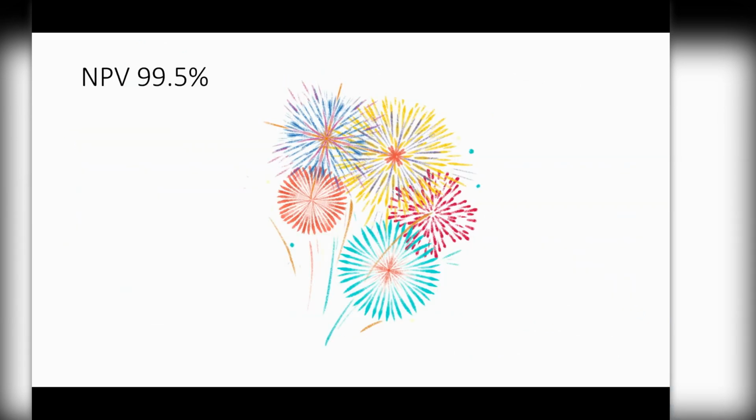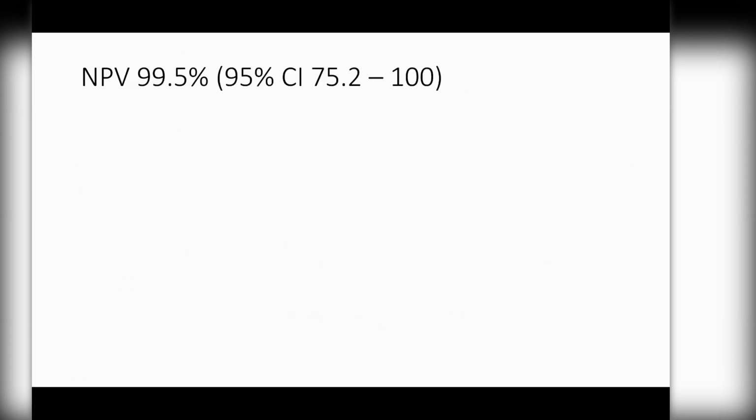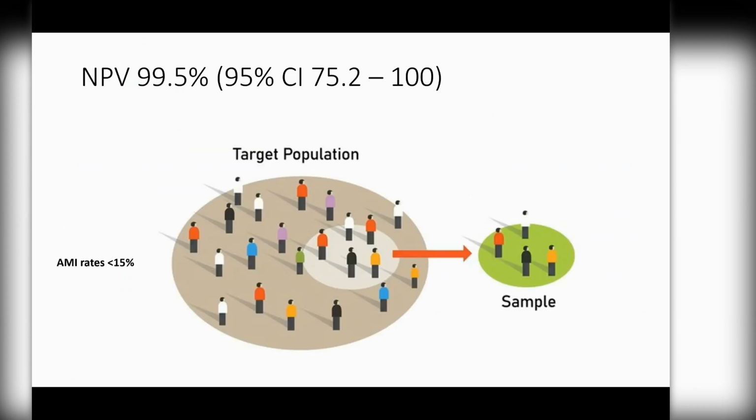And just as a tiny little segue before I end, one of the things that I look at when we see a number of publications in this area is you often see people publishing fabulous point estimates of things like negative predictive value being 99.5%. And look, this is great. And what this really means is that we'll only miss one patient with an MI in 200 patients. But I'd argue, please also look at things like the confidence intervals, the range around them, and some of them, concerningly, when the studies are small, get quite low. And it's because our event rate, the true AMI rate in the ED population, is low. And if we have a small sample size, we are going to miss identifying those patients. So we need very large studies. It does mean these studies are hard to do, but we need them to ensure accuracy.